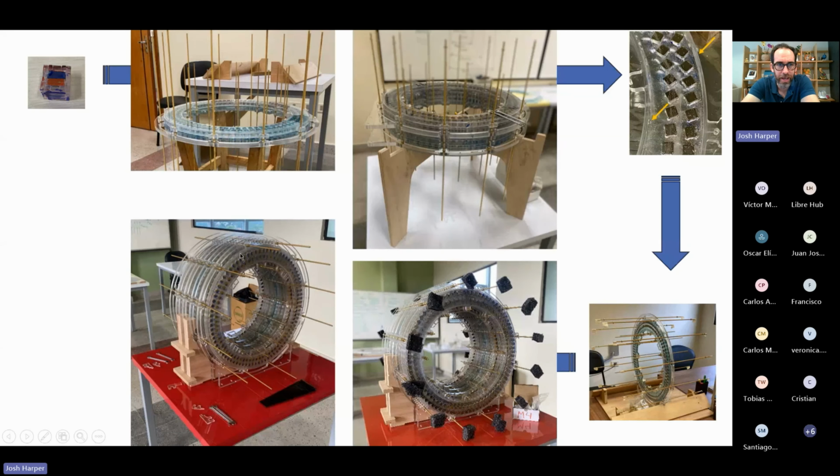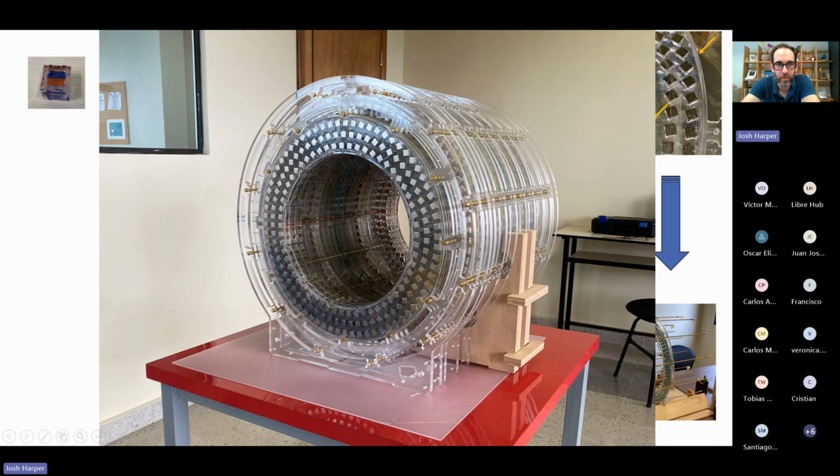And then you just keep adding rings to the system. It's very exciting because the magnetic field plays tricks with your minds. Sometimes it pushes, sometimes it pulls, which is a lot of fun. And eventually you have a full magnet built and it looks very beautiful like this one. And depending on how much personnel and time you have, you could do this in probably between a week to a month and a half if you work steadily.